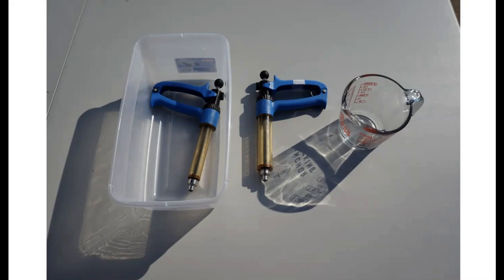Now, the other thing some of you may be sitting there thinking about is, did I just say that I put a metal needle in the microwave? Yes, I did. The reason I do that is twofold. One, it basically sterilizes my needle for me because I have it in boiling water. But the more important reason is that when you heat water or coffee or something in the microwave, especially in a container that's really slick, you can have a situation where that liquid will get above boiling temperature but won't actually boil. It won't actually bubble. What happens if that occurs? When you reach in there and grab it and you break the surface tension of that water, it can actually cause that superheated water to explode, which is something you don't want to have happen.